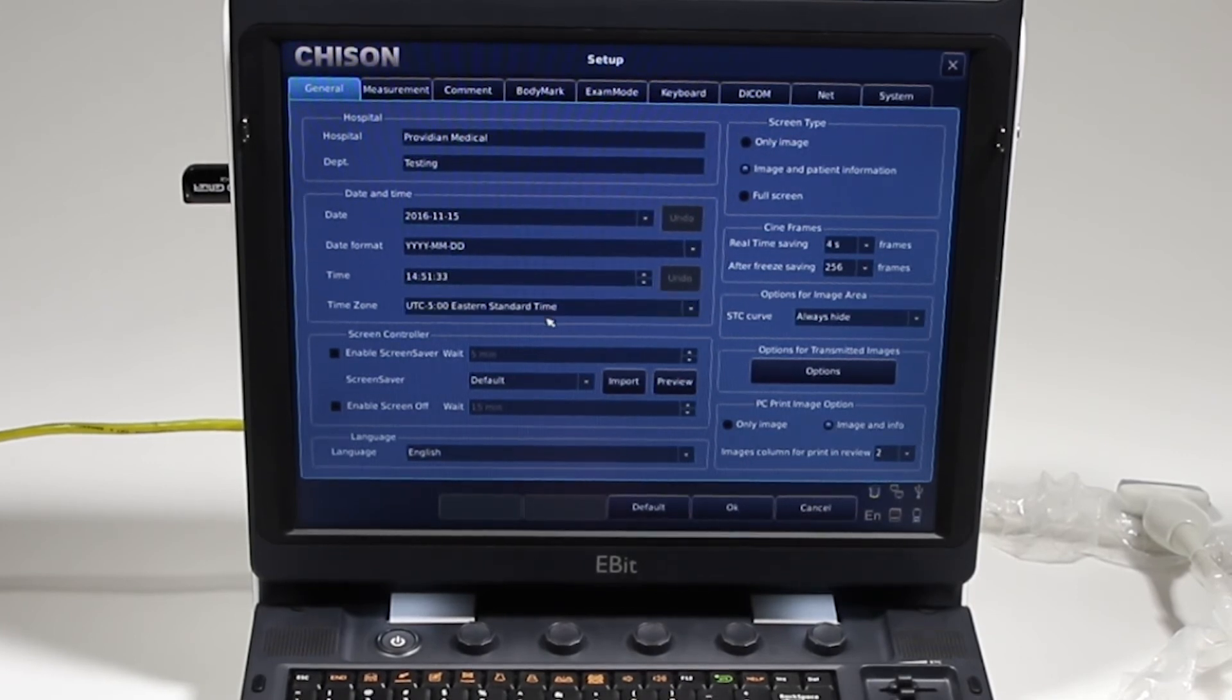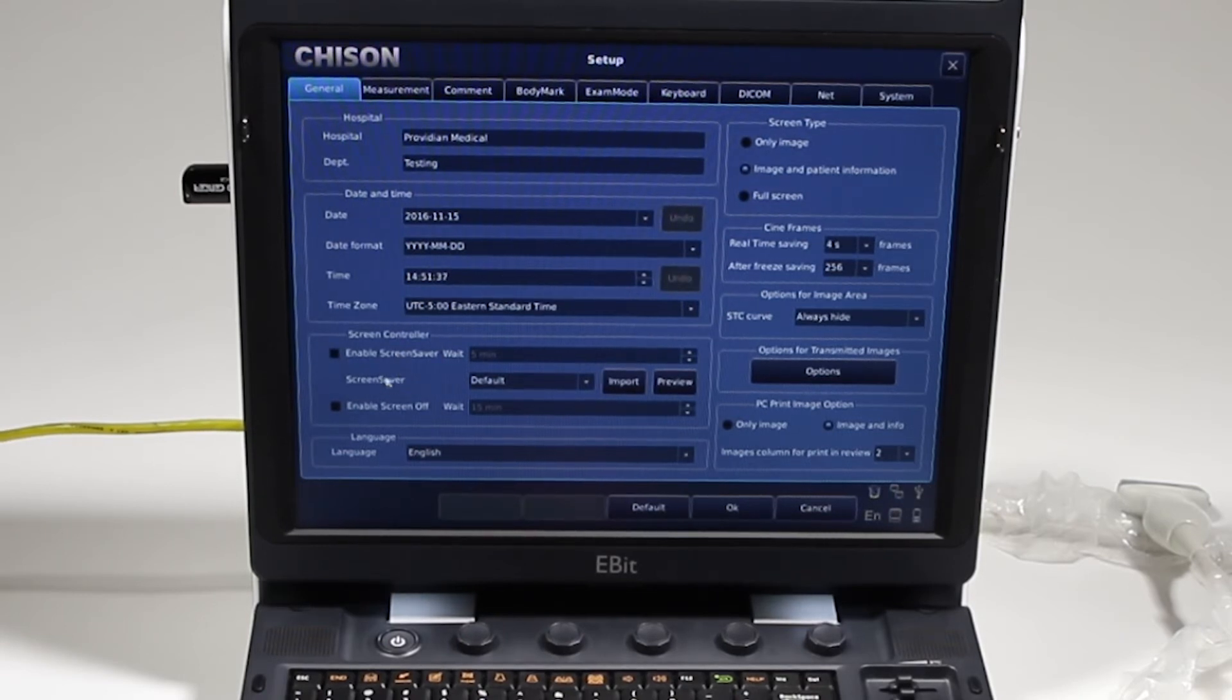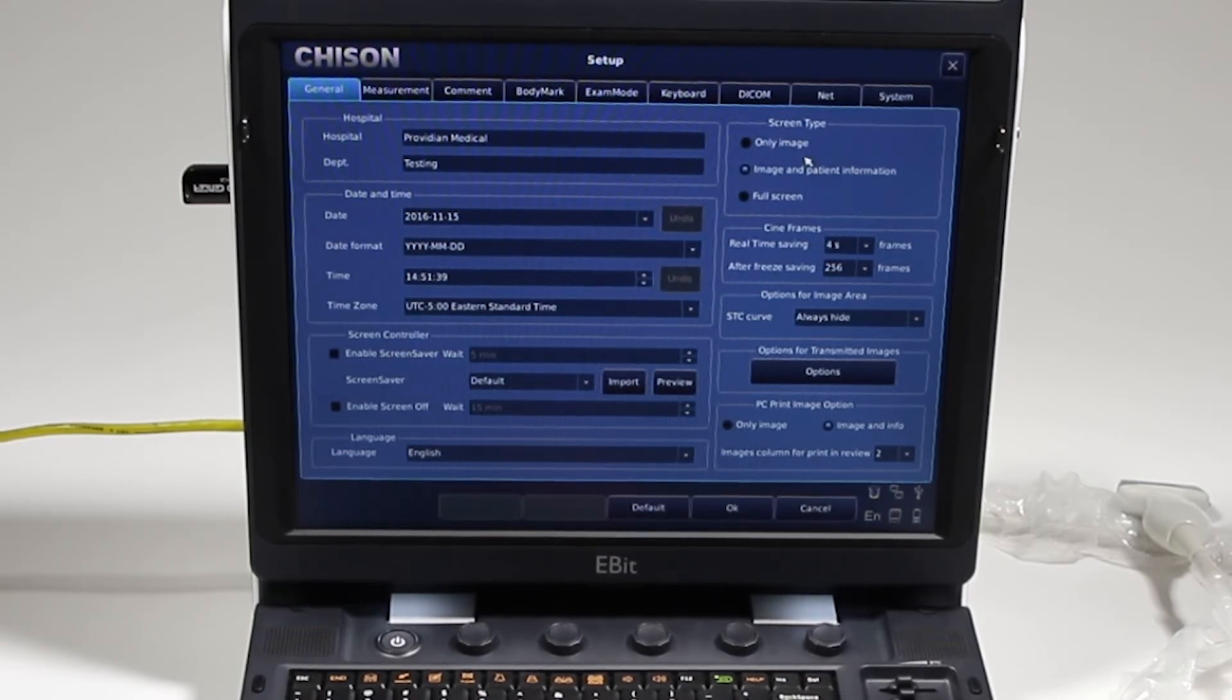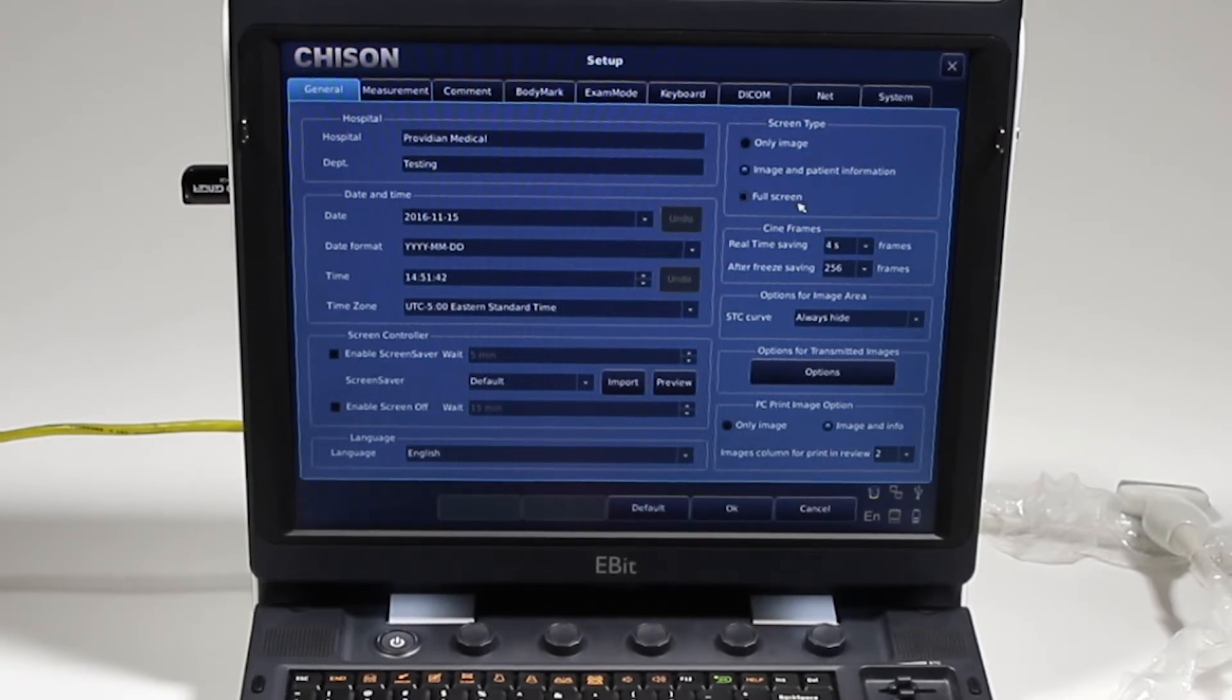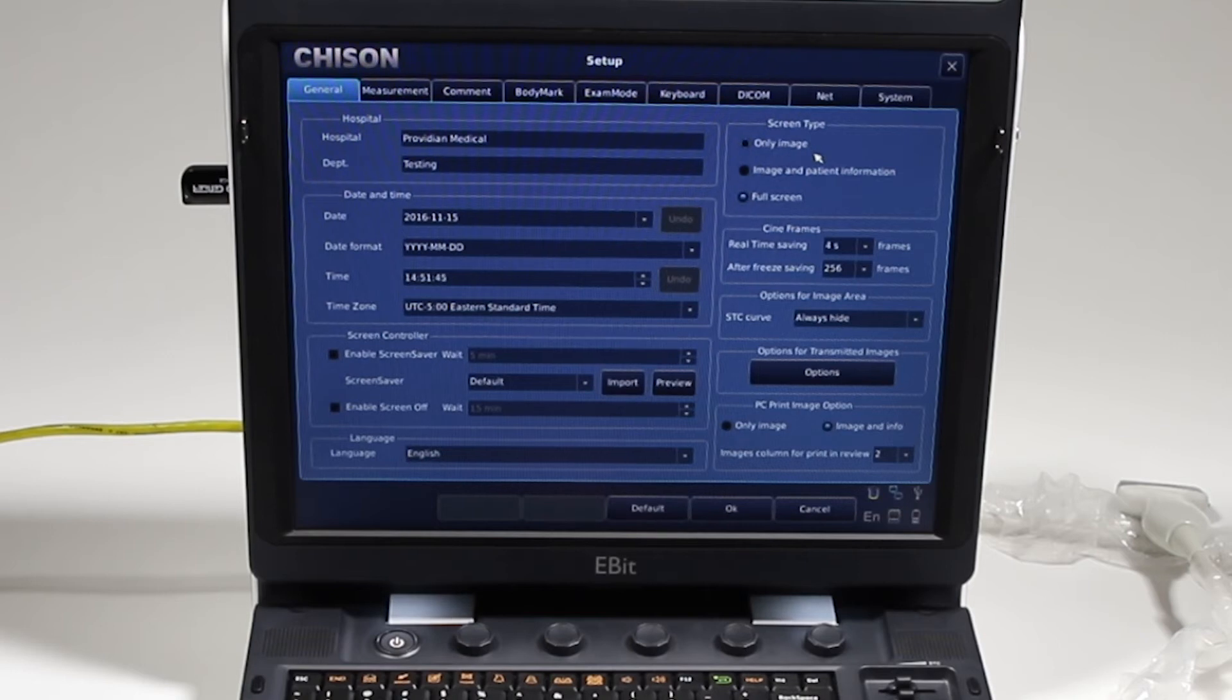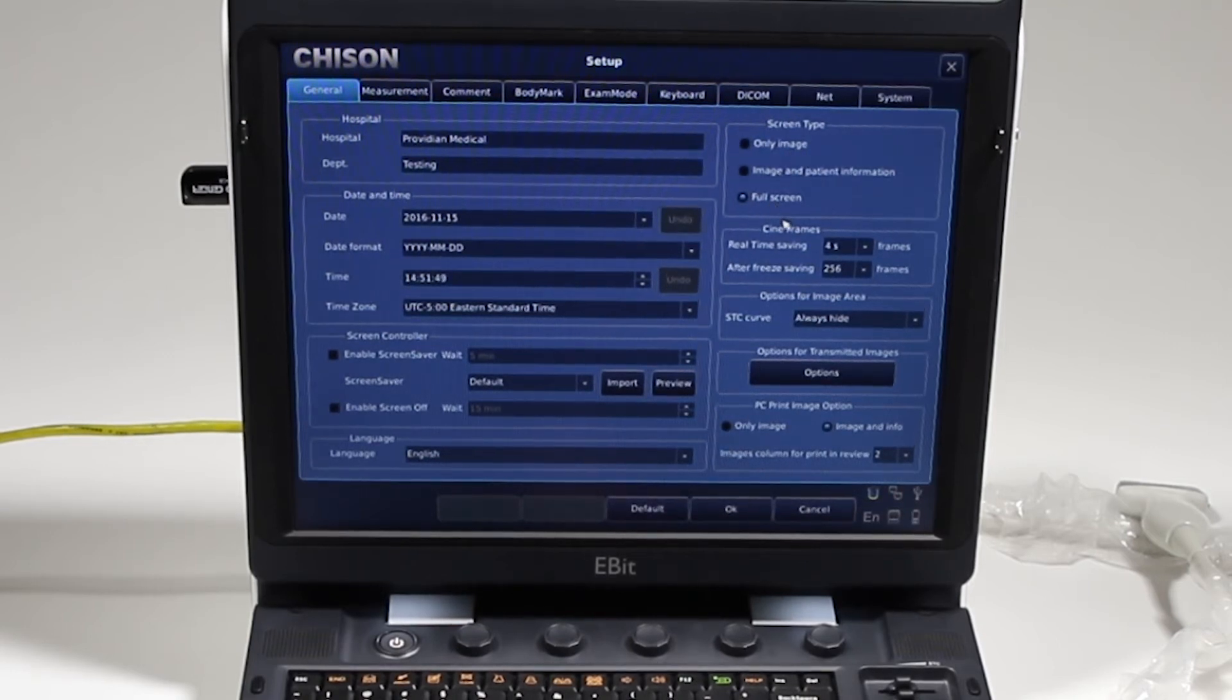First you're going to enter your information here, your department. Make sure the date and time are correct. Screen saver, typically I leave these off so they don't just appear in the middle of an exam. Screen type: how are you going to save the screen when you hit the save button?